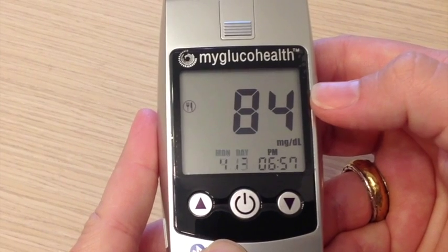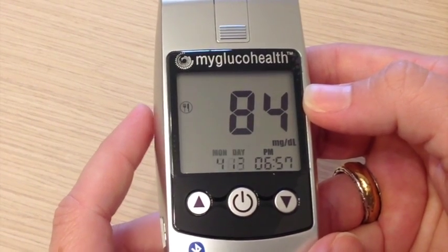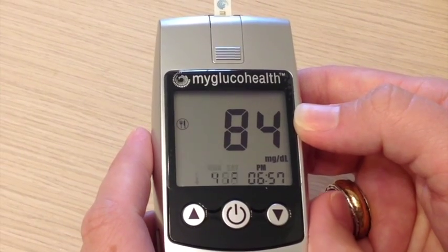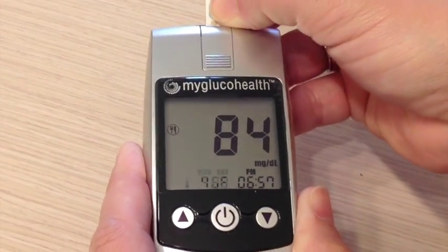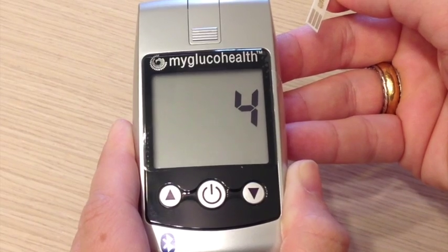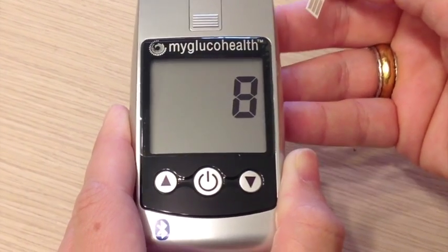It shows that my blood sugar is 84. With these meters, they connect via Bluetooth. Depending on what study you're in depends on which Bluetooth device you will be using, but they all work the same. When you take the strip out, the meter will automatically start searching for your Bluetooth signal, and that's how it transmits your blood sugar so that we can see it here and determine what your reading is.